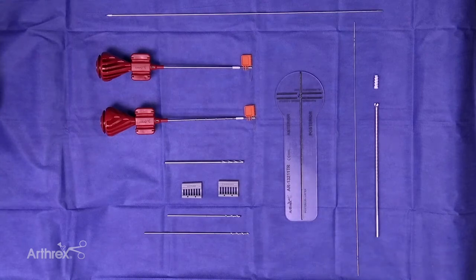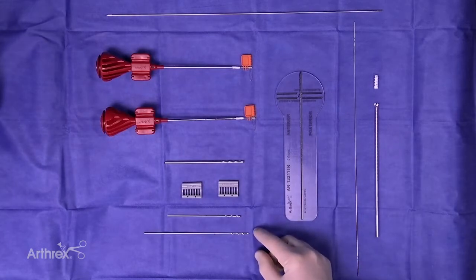I'd like to discuss the features of the new 3.9 Biocomposite Swivlock MPFL kit. A couple things to start are some new drill bits. These are 2-4 diameter.